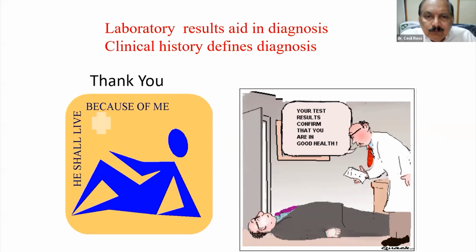What is the cutoff from the control we take for PT or APTT to be normal? That will depend on the laboratory. Every time you do an APTT or a PT, the laboratory runs a control. Sometimes the PT control is 12 seconds, 13 seconds, 15 seconds. And therefore in patients' PT, you have an INR, which is normalized depending on the oral anticoagulant. So that is a different thing.